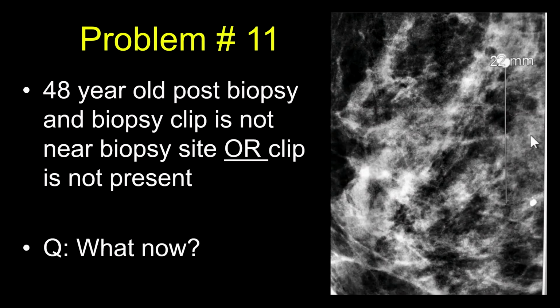How about this problem? A 48-year-old post-biopsy, and her biopsy clip is at least 2 centimeters away from where you sampled. Or even worse, maybe your clip is not even present. What do you do at that point?